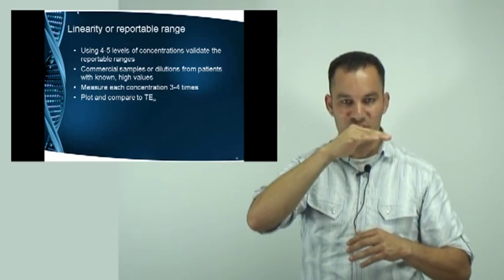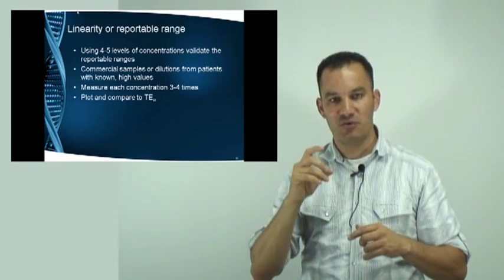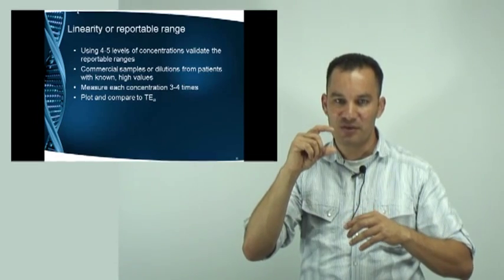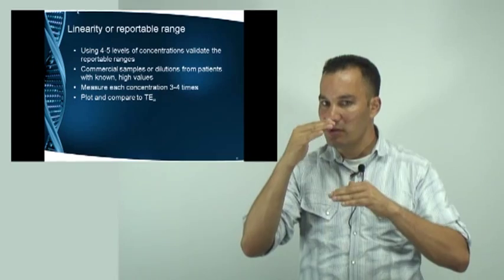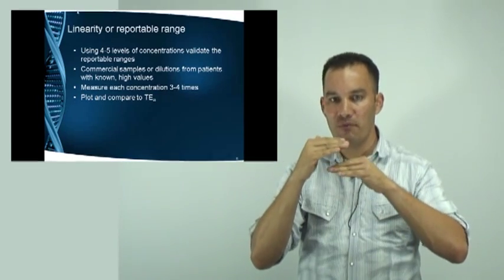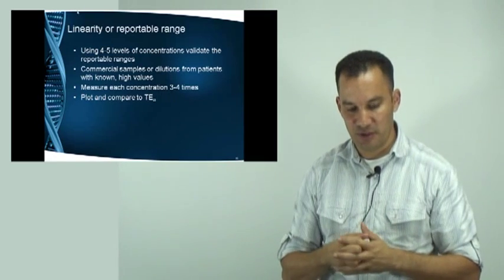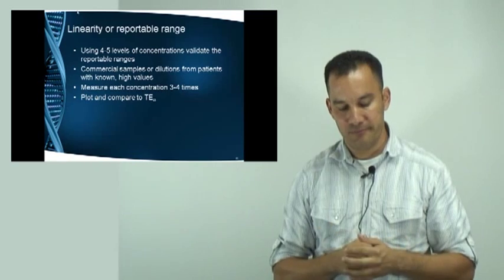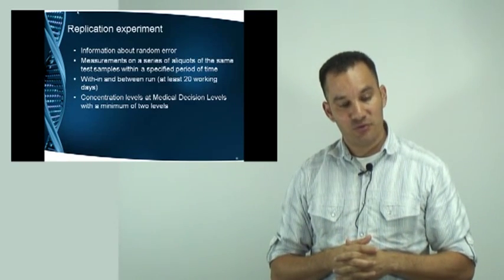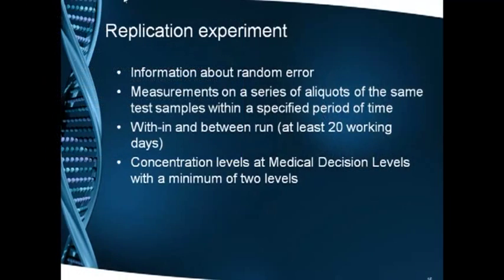Their concentration in the blood is very small, so this will mean that your total allowable error is very small, and that as an analytical new method there is not very much room for error there. So that's something that you will use in trying to verify if the method is linear.